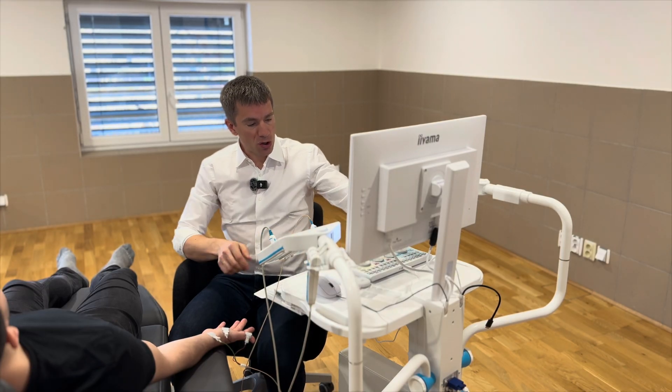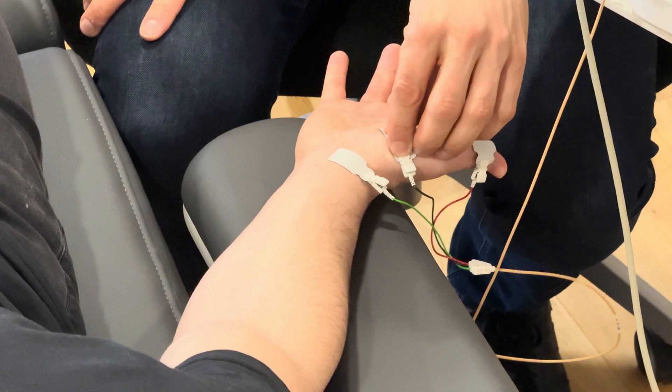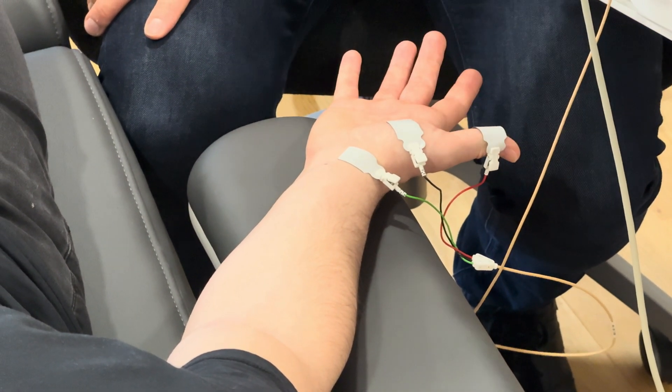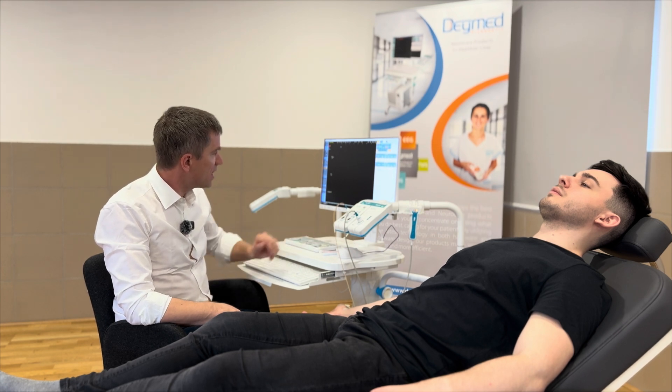Now let's check on the screen of the Daymat machine the impedance by pressing this button. It's quite okay. I can press the recording electrodes. The impedance for the motor nerve conduction study is enough. I press again on this button. I am ready to stimulate.